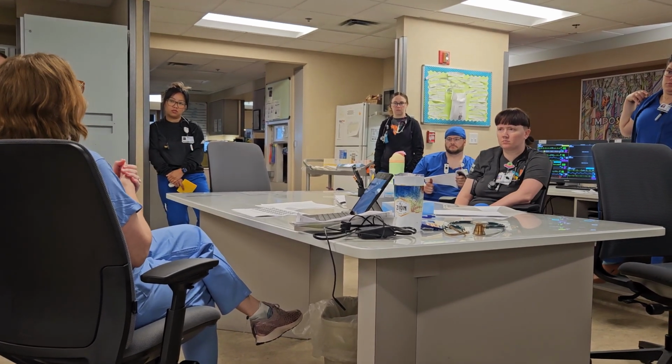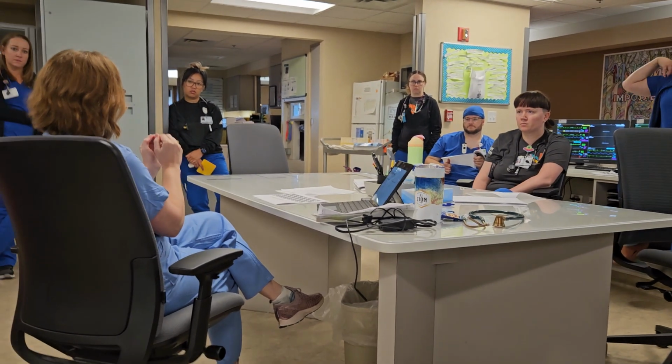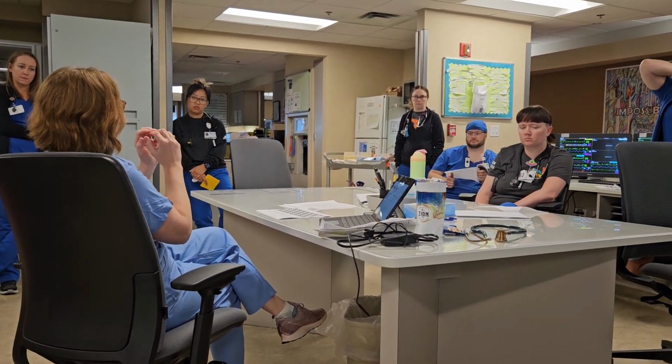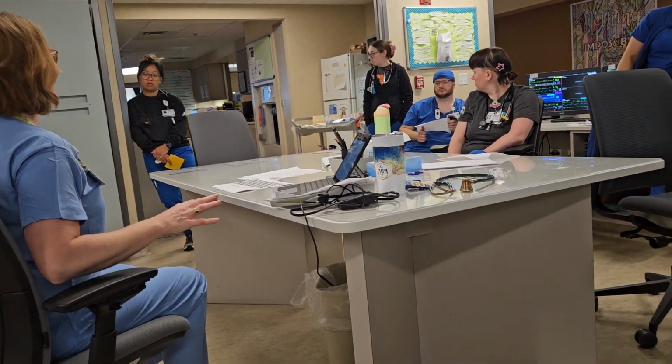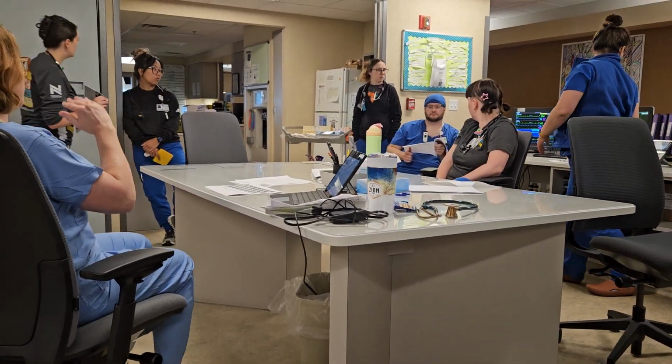To wean somebody from the ventilator, FiO2 less than 60%. If you've got somebody that's really got severe hypoxic respiratory failure, we wean FiO2 before we wean PEEP, always.